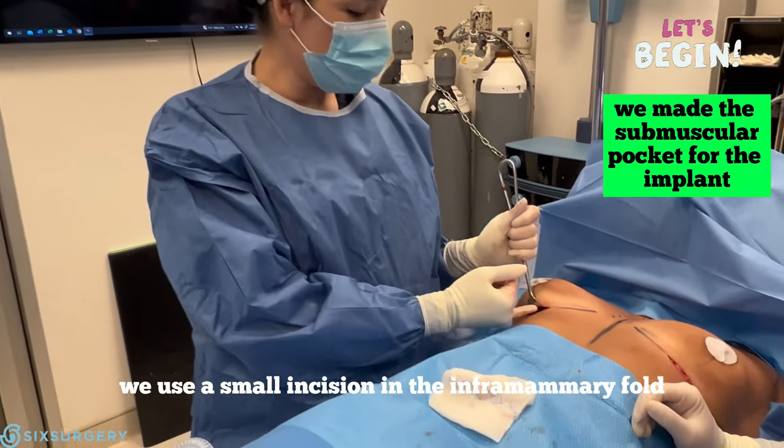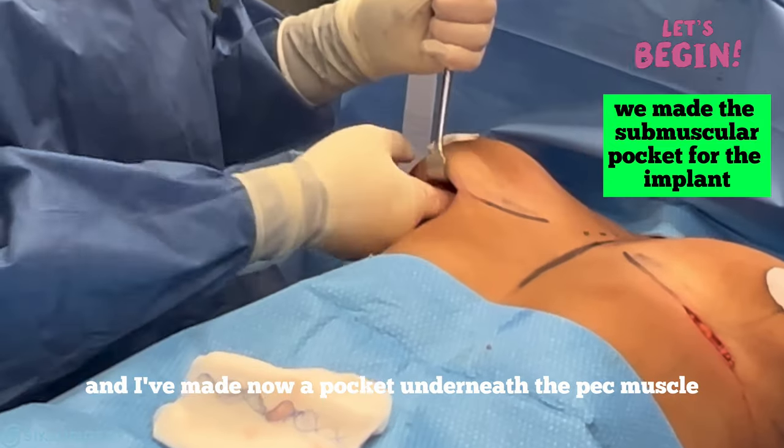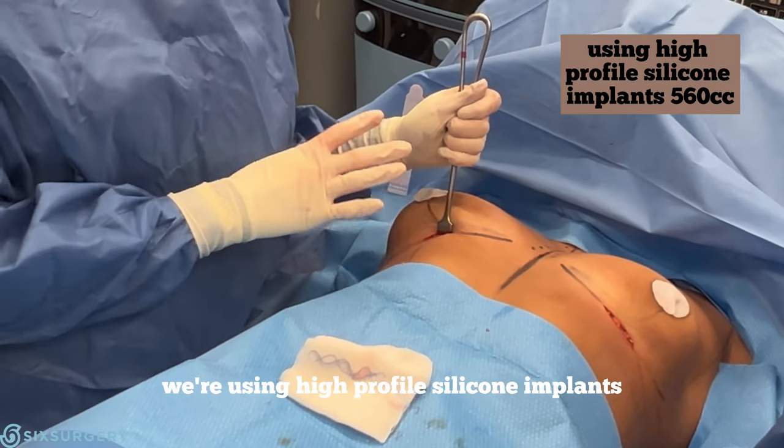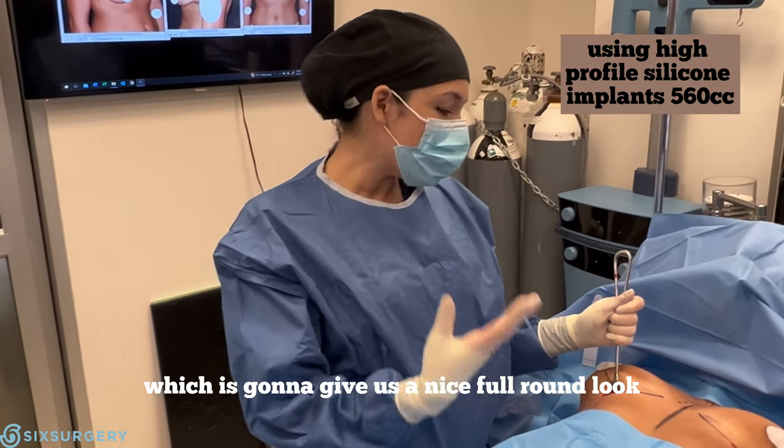To put the implant in, we use a small incision in the inframammary fold. I've now made a pocket underneath the pec muscle — that is where we're going to put the implant. We're using high-profile silicone implants for this case, which is going to give us a nice full round look but still harmonious with her frame.